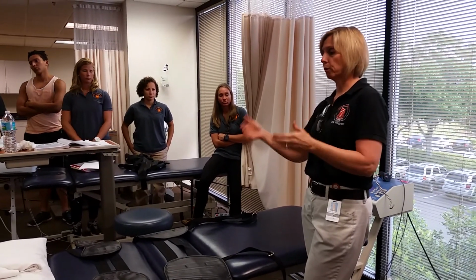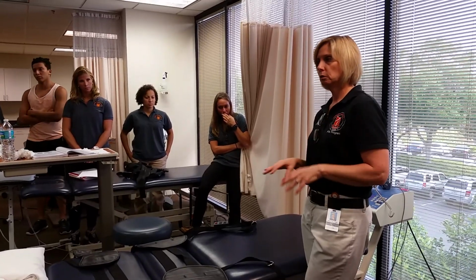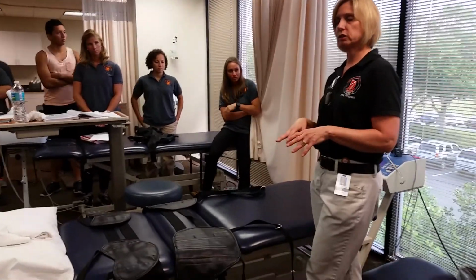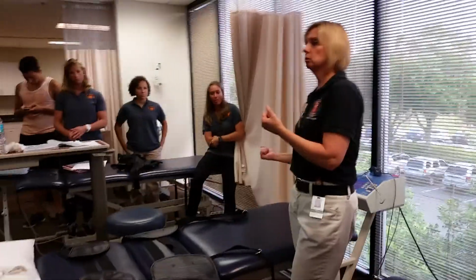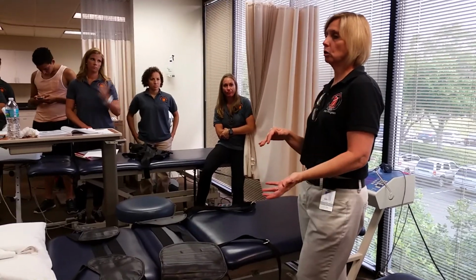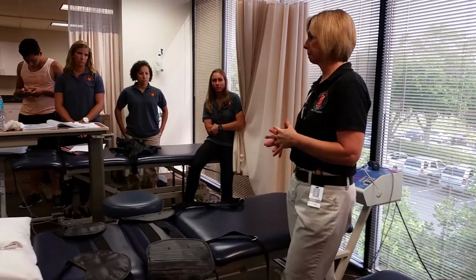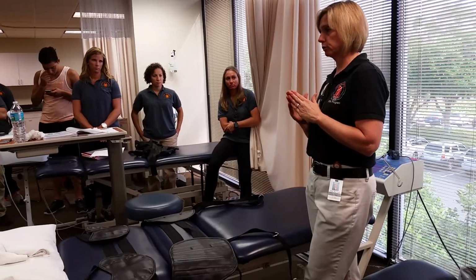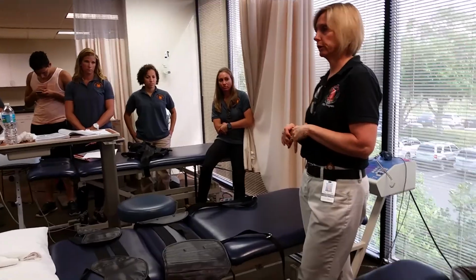Okay. And then the process of breaking it down. Make sure you loosen everything up first, make sure everything gives it a second to resettle, rock the pelvis a little bit, then you can remove the stool, and then once you open up all the straps, they can slowly log roll to the side and sit up. And lock the table first. Lock the table first so you don't forget. Very easy to forget.